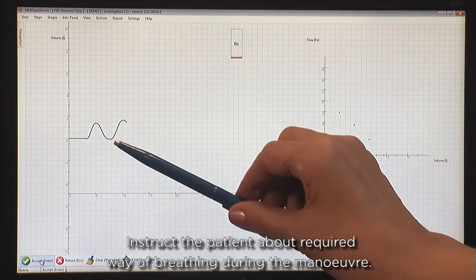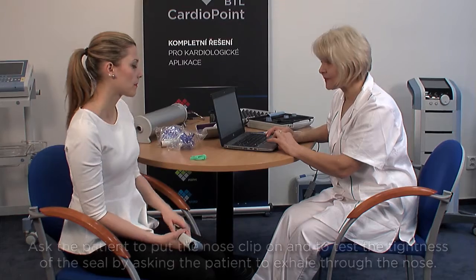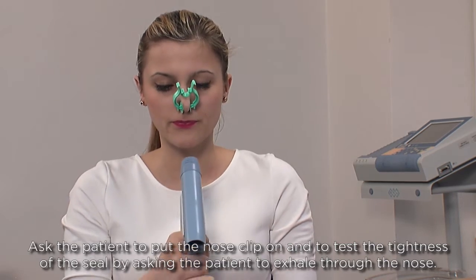Instruct the patient about the required way of breathing during the manoeuvre. Ask the patient to put the nose clip on and to test the tightness of the seal by asking the patient to exhale through the nose.